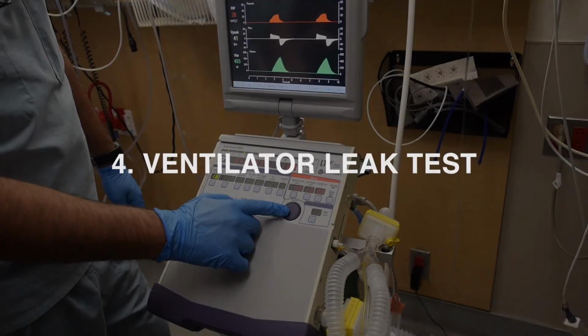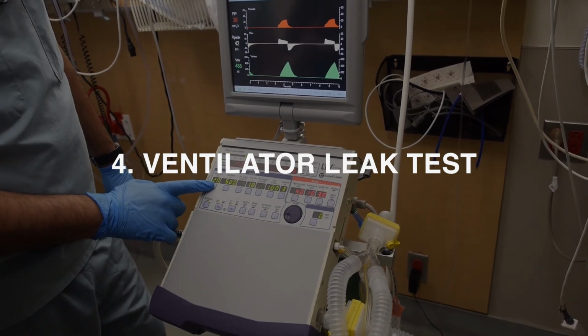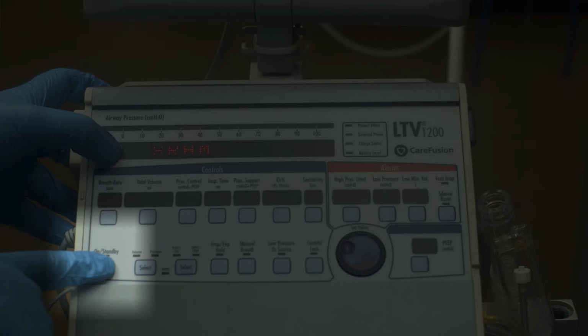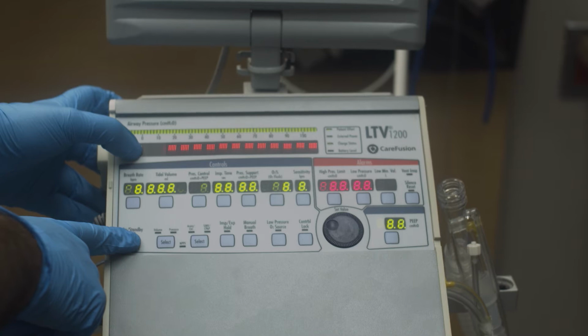Once the ventilator is connected, a leak test is the next step. This is perhaps the most complicated task you'll perform, but we're going to walk you through it. First, press and hold the select button, and then the on/standby button at the same time. This will start the ventilator and allow you to enter the leak test mode.